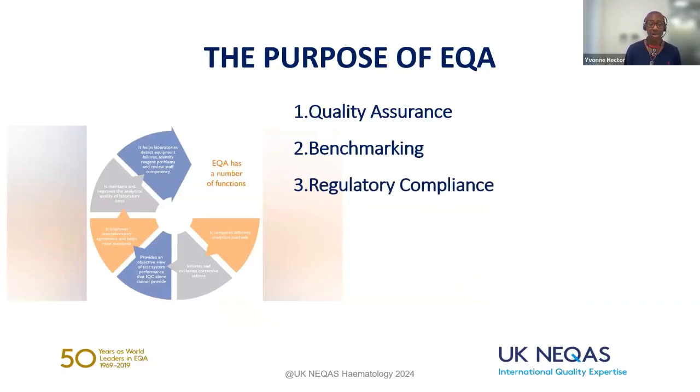We've got regulatory compliance. Many regulatory bodies and accreditation organizations do require participation in EQA programs, depending where you are in the world, as part of your certification process. And regular participation demonstrates your commitment to maintaining high standards within your working organization. Training and development: EQA provides an opportunity for lab staff to learn and improve their skills, and the feedback from EQA programs can be used for training purposes and to enhance the competence of lab staff.